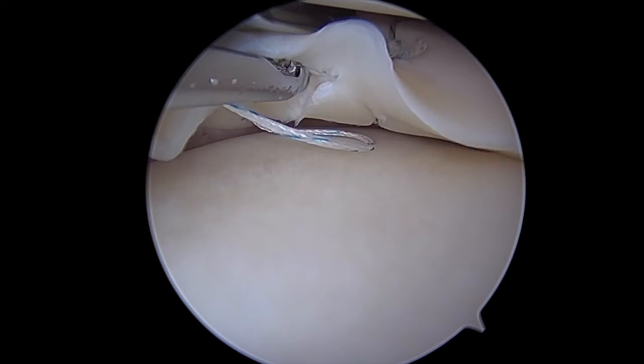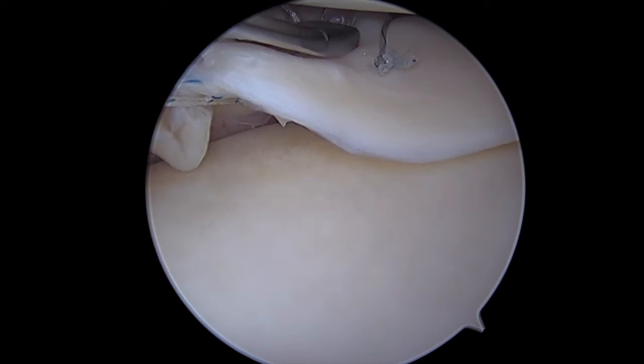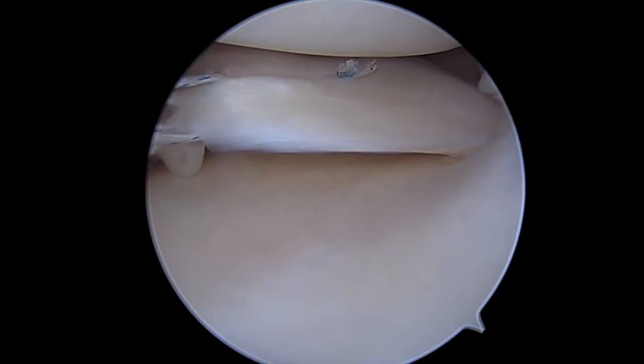I've gotten a much better pass because I trephinated much more along the meniscus itself, penetrating through and around. Now I've got my stitch around and I'm able to sew this back to the margin.